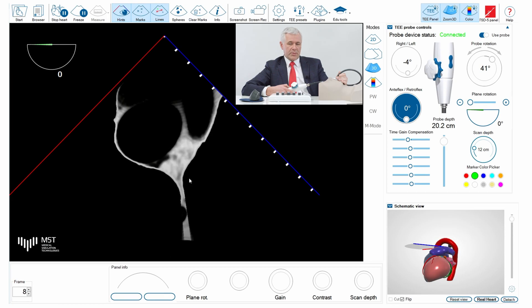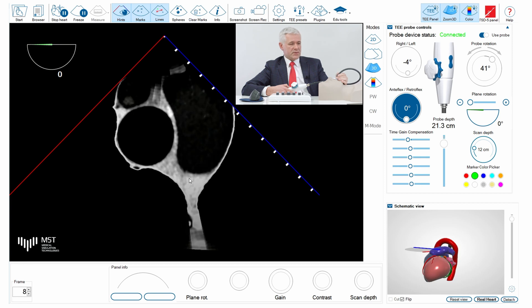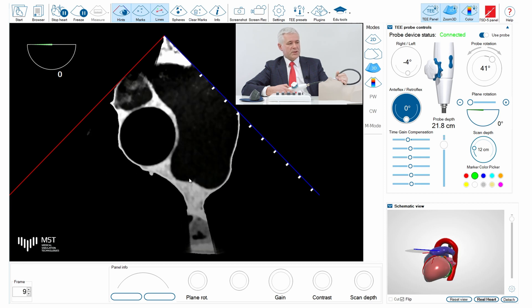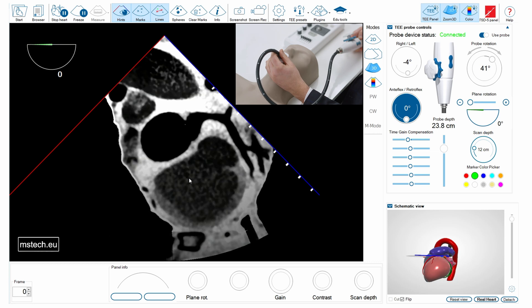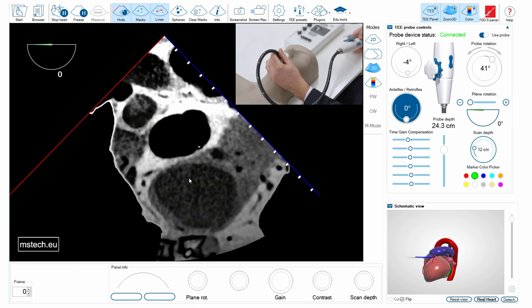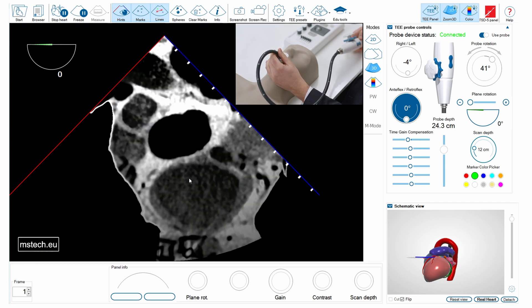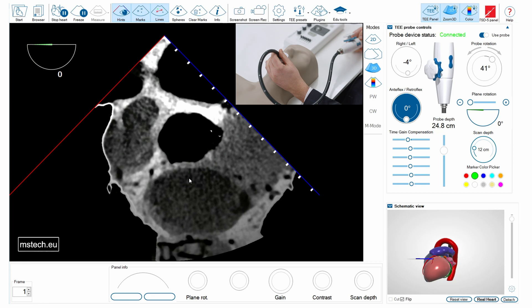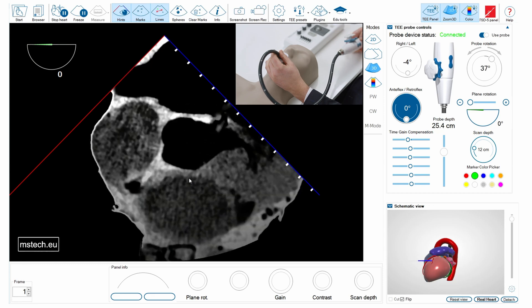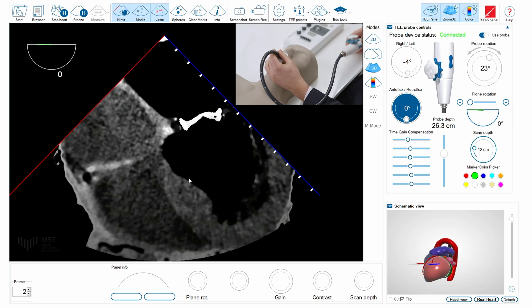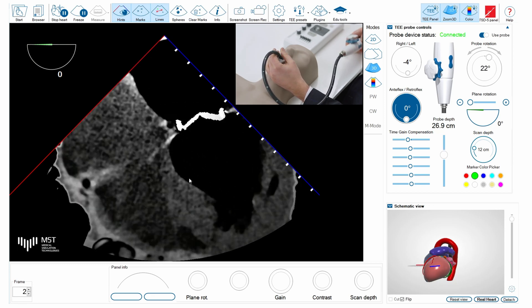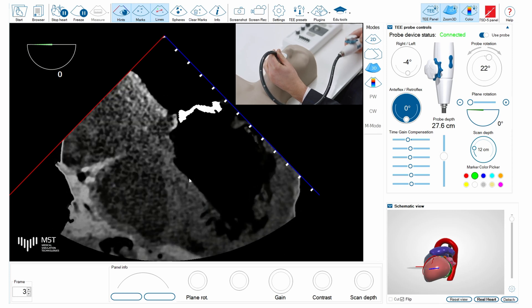I'm now in the upper esophageal views looking at the aorta and pulmonary artery, which is dilated, and then I go deeper. I can see now the ostia of the coronary vessels and the aortic valve, and now I am at the level of the mitral valve.